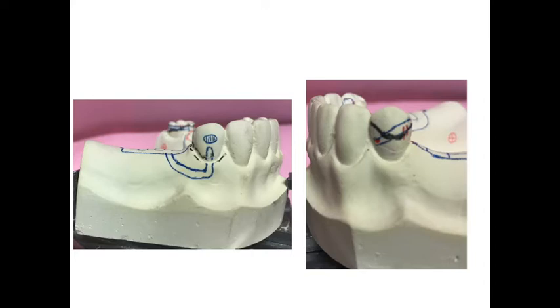And this is the alternative option. Actually, I don't have undercut here. I don't have undercut on the canine, on the premolar, on the 28th area. So what do I do? I should add a composite. You see, I add this one, a composite. I draw my I-bar here and I draw a survey line. You see the survey line is close to the free gingival margin because I couldn't get undercut here. That's why I will add the composite here.